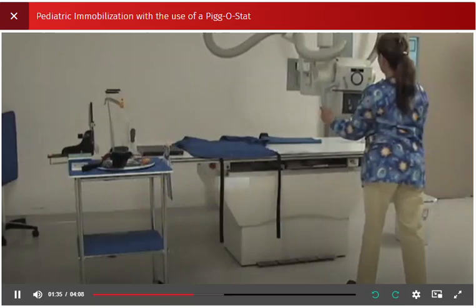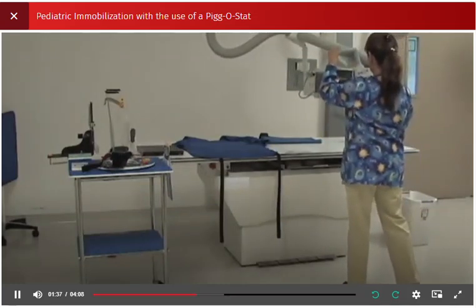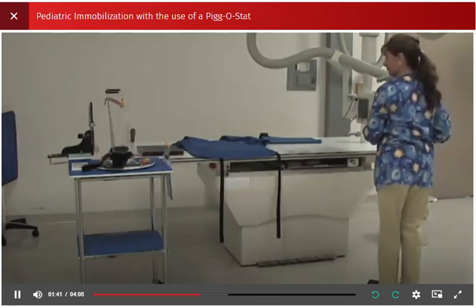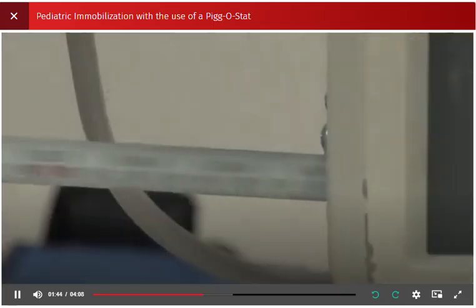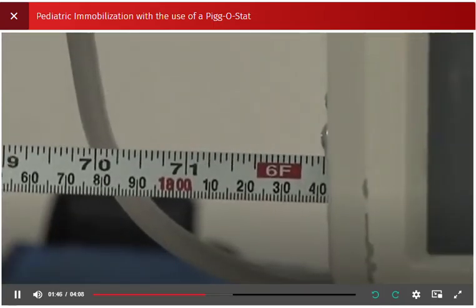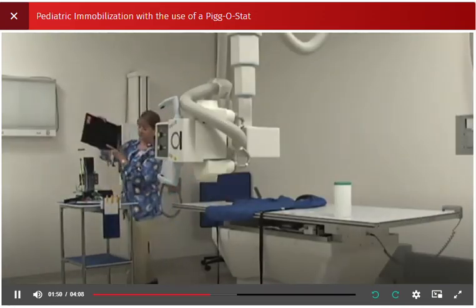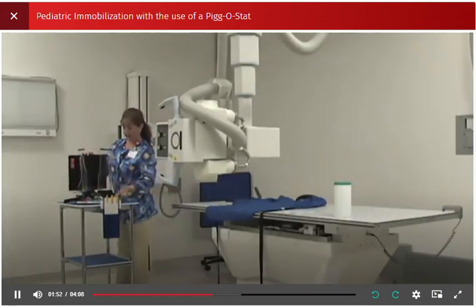Move and adjust the X-ray tube in the horizontal position and center to the image receptor. Adjust the X-ray tube to obtain 72 inches source to image distance or departmental standard distance. Place the appropriate size image receptor in the holder and lock into place.